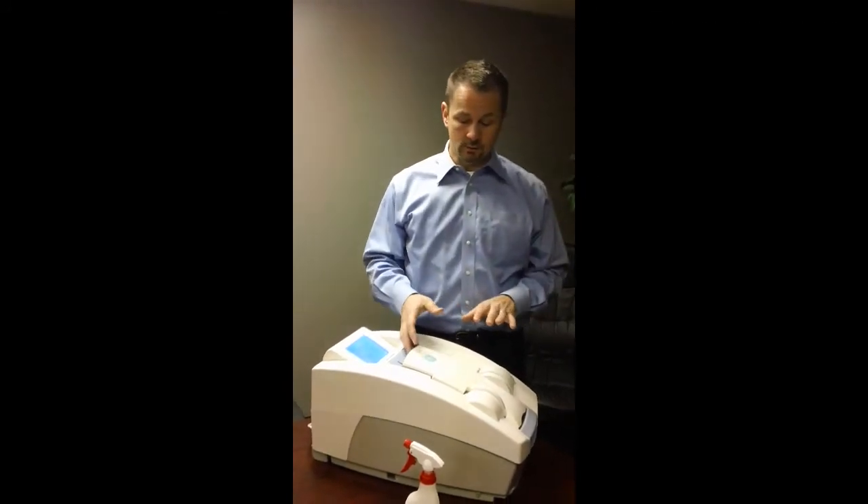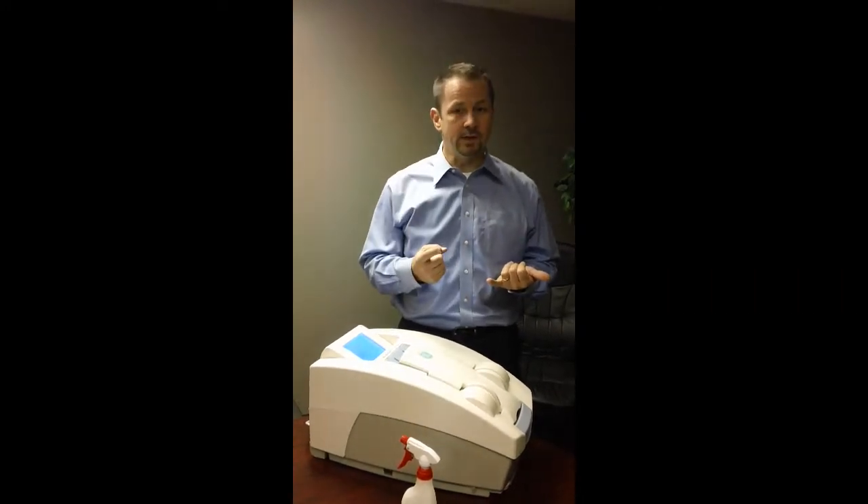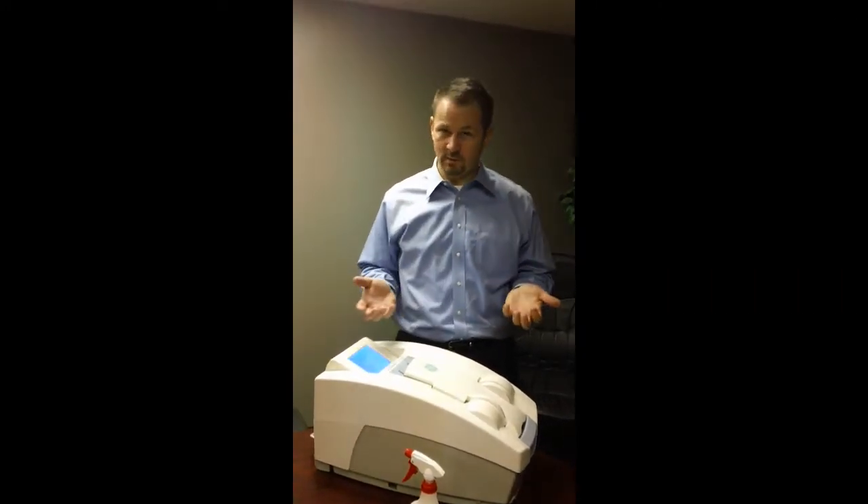Typically what we'll do is we'll do a QA first, which needs to happen just once a week. And then we'll actually scan a foot, so you can see the process for both.